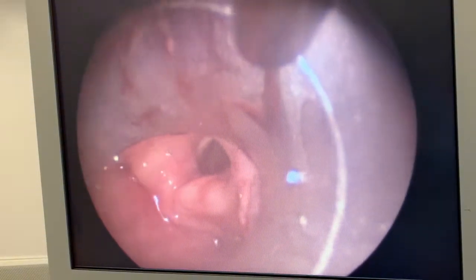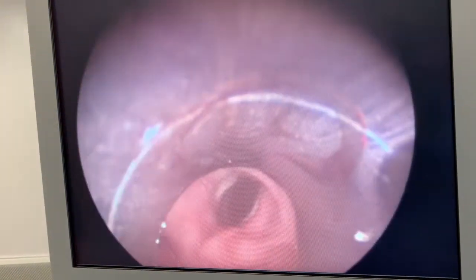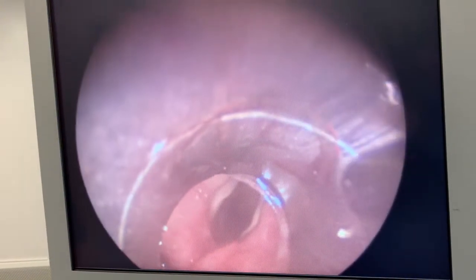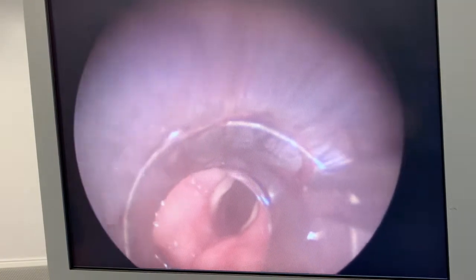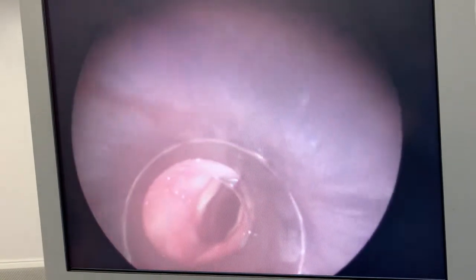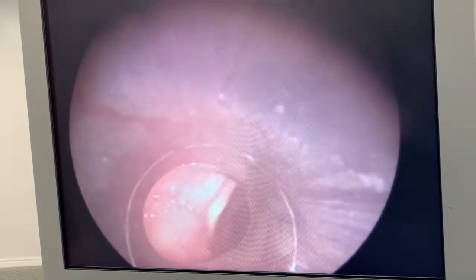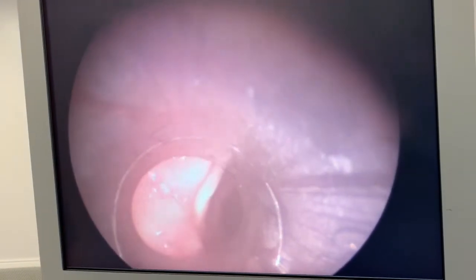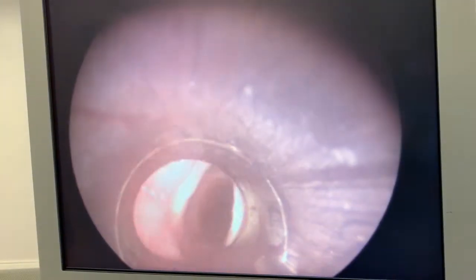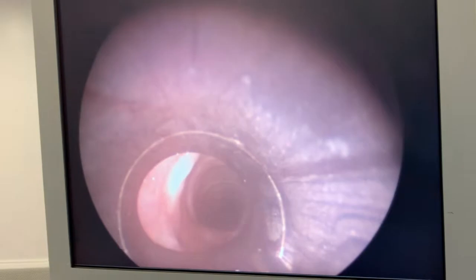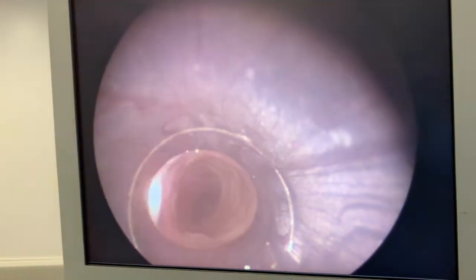We lift that up with the edge of the rigid bronchoscope to expose the vocal cords. The scope is then turned 90 degrees to the right so the bevel can be introduced through the cords.